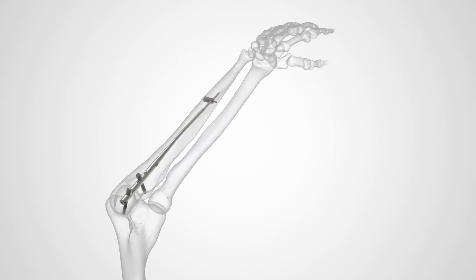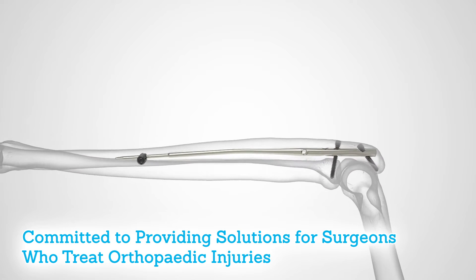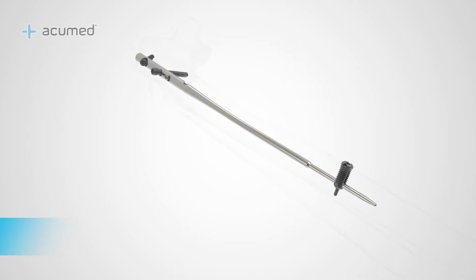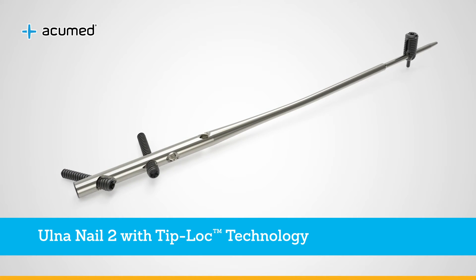Acumed is committed to providing solutions for surgeons who treat orthopedic injuries. The Acumed fibula and forearm nail 2 system represents our continued promise to offer options for fixation of trauma to the upper and lower extremities.